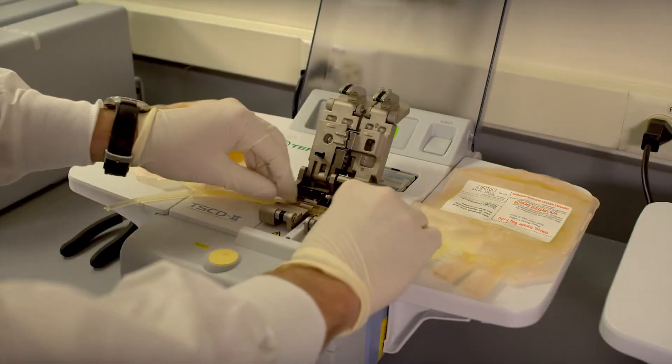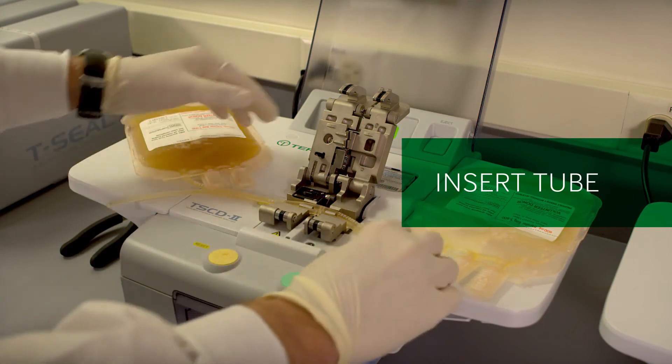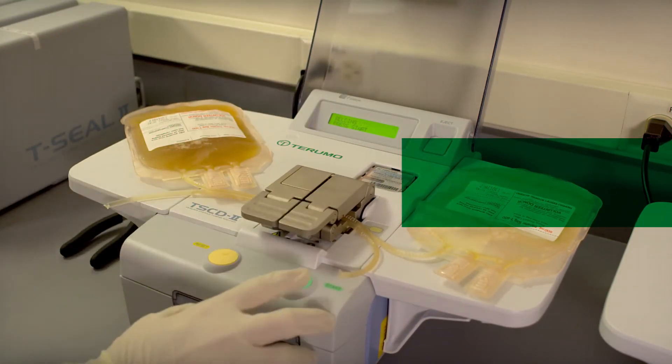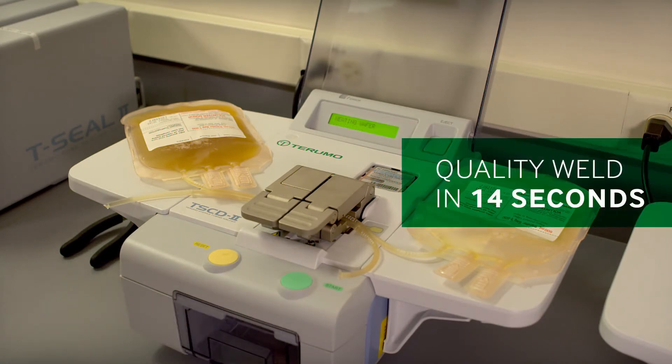Simplicity. The TS-CD2 welder has been designed for simplicity. Just insert the tubing into the welder, close the clamp and push the button. The device does the rest, creating a quality weld within 14 seconds.